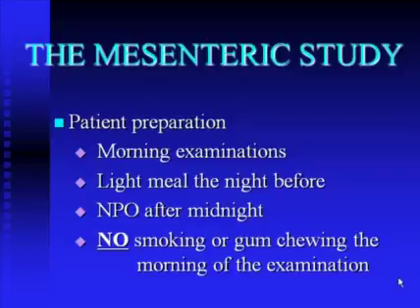In terms of the technique, in preparing the patient, it's relatively straightforward. These are outpatient studies. There is no urgency about this. It is a chronic process. It has been going on for months, if not years. So they are scheduled first thing in the morning, because the day before the examination, we call and remind the patient that they should have a light meal the night before. They should try not to eat any heavy foods or greasy or fatty foods. After midnight, they should be NPO.